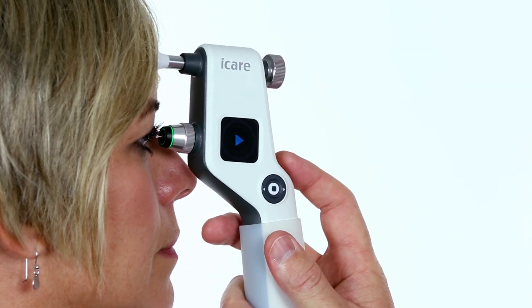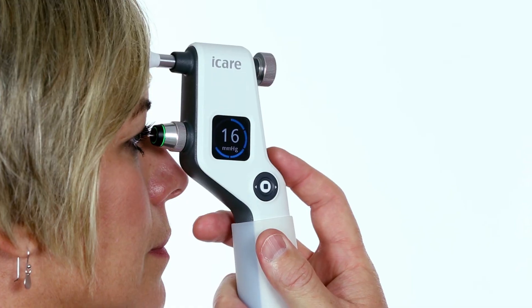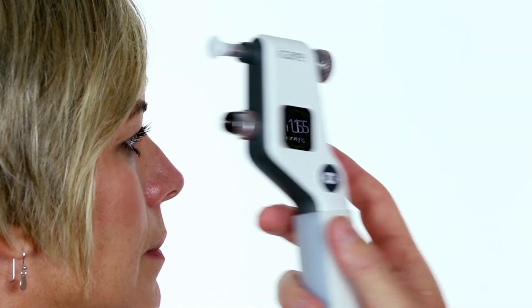To perform individual measurements, press the measure button lightly six separate times, or until you hear a long beep.